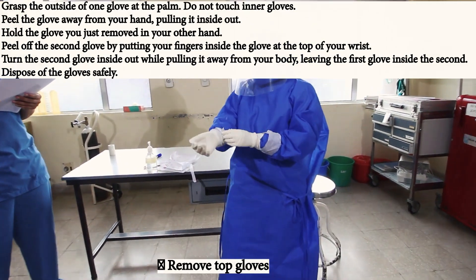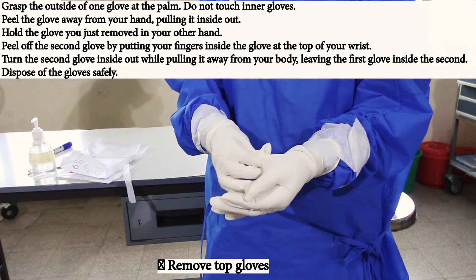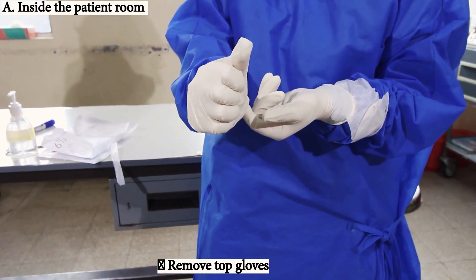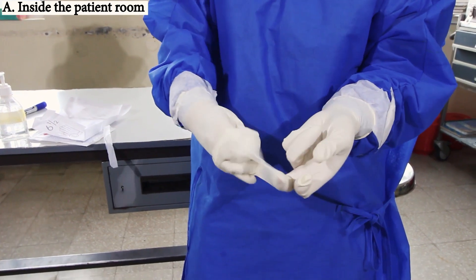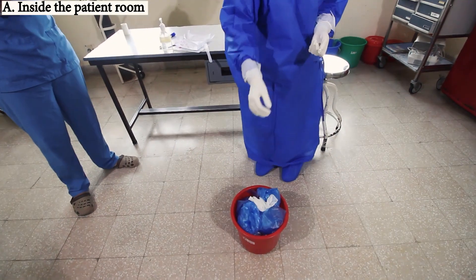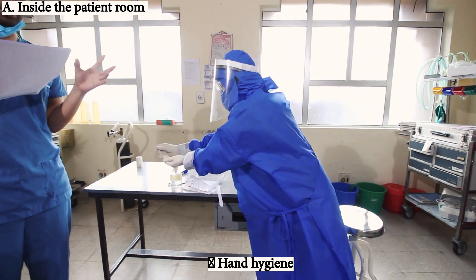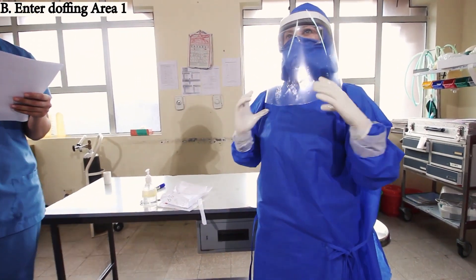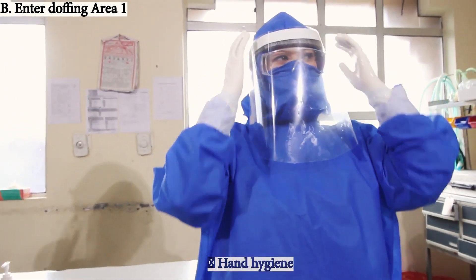Remove the top gloves and perform hand hygiene again. This completes our patient room checklist. Now after hand hygiene, we move to Area 1 where we again perform hand hygiene.